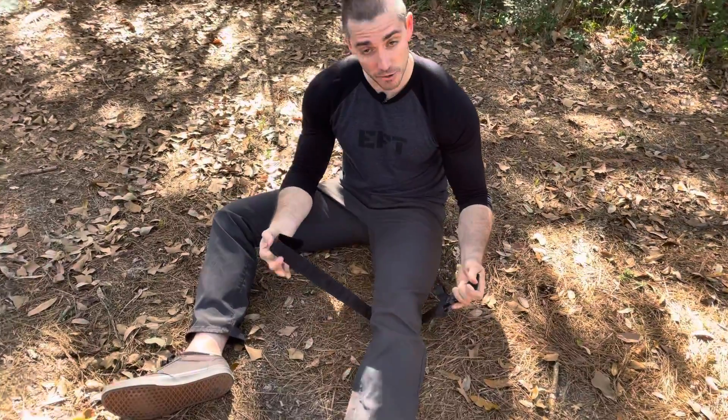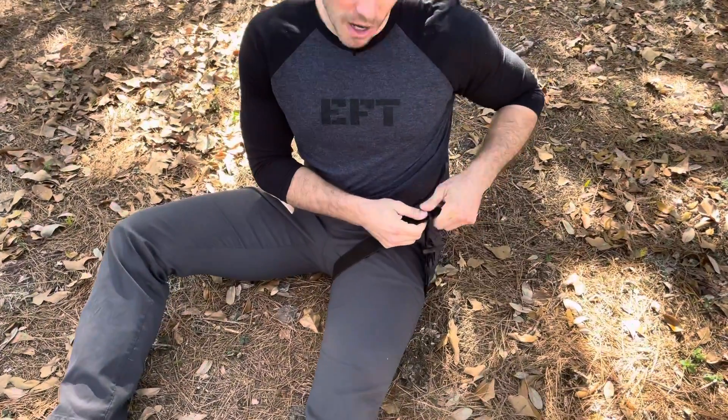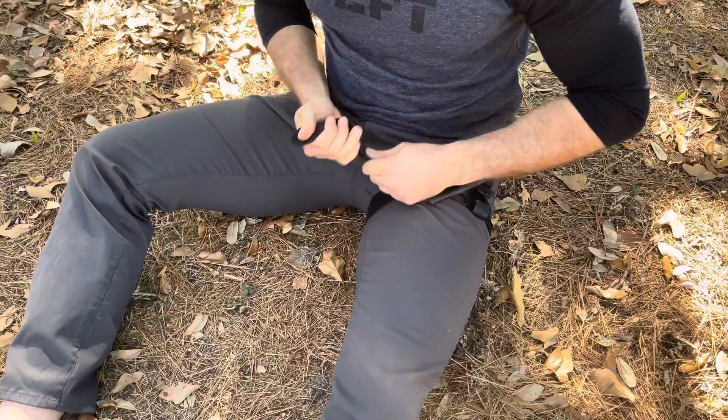Slide the buckle underneath the knee. Shimmy it up as high as you can into the groin area. Make sure nothing is in your pockets — handcuff keys, knives, etc.